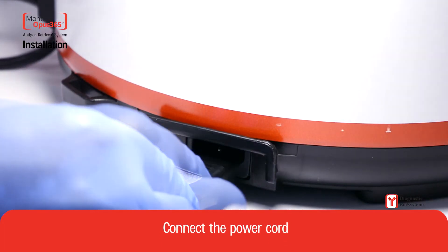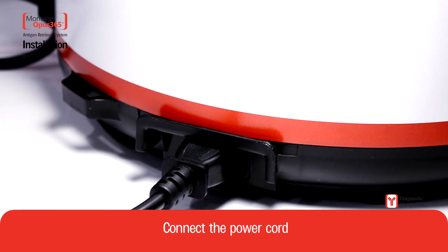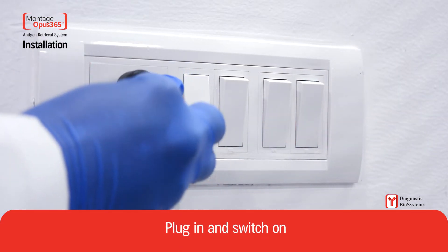Connect the power cord. Plug in and switch on.